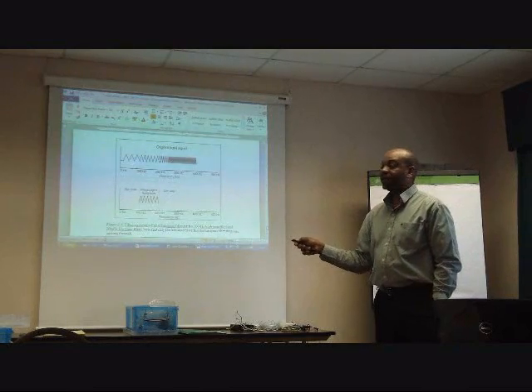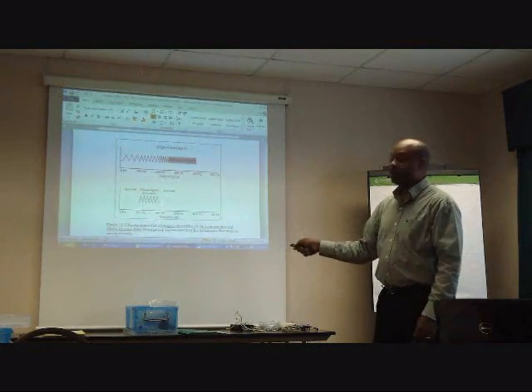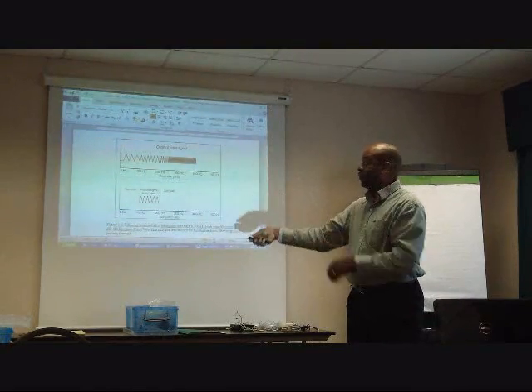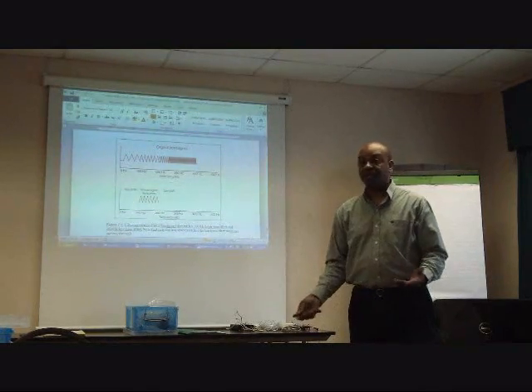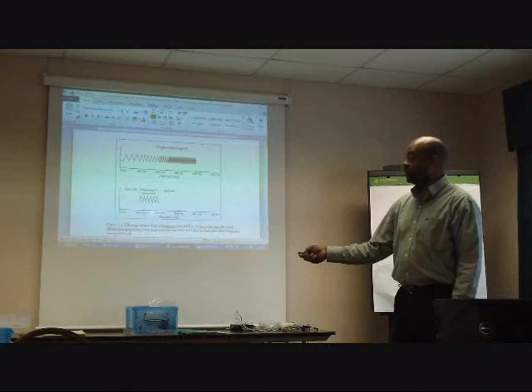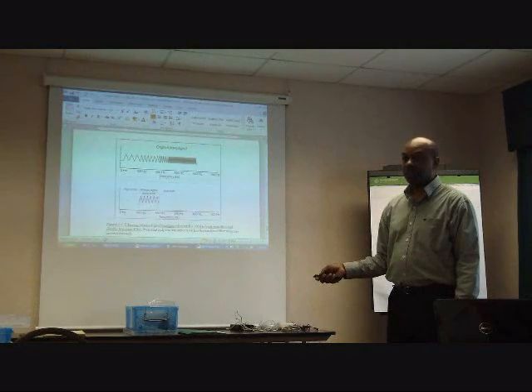So what's going to happen is we'll see a reading going along for the EMG, that's the upper back, but we'll keep seeing this big spike. And that's because every time the heart beats, it's putting out a huge amplitude at a frequency that's within this range here. And it's going to interfere with us doing the work on the muscle on the back. But what happens if we switch to this frequency range? It's excluding this stuff. So we're not going to see the heart artifact.